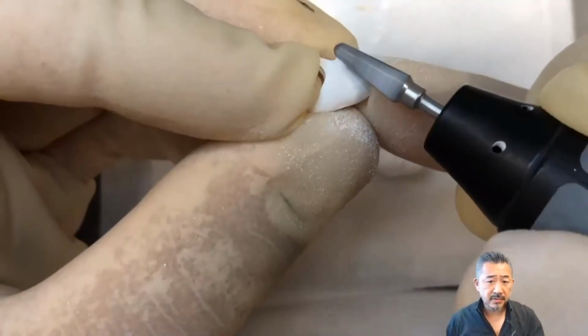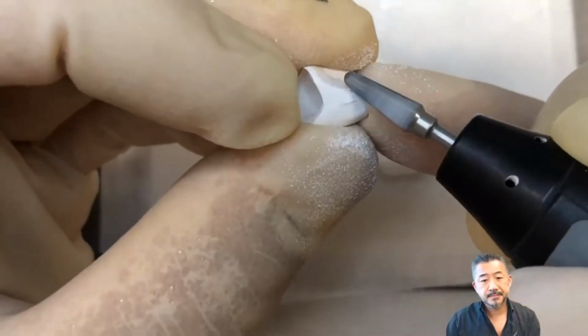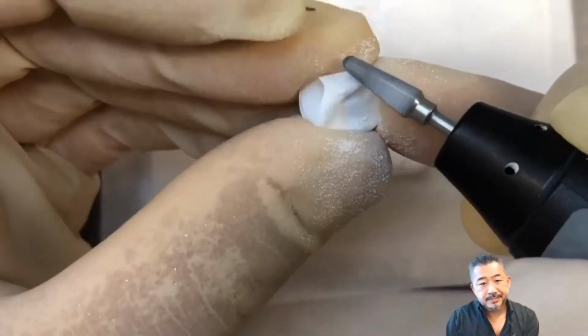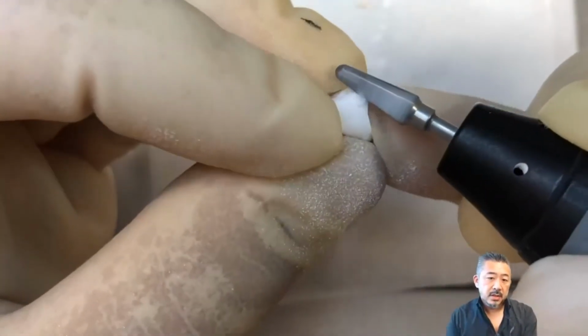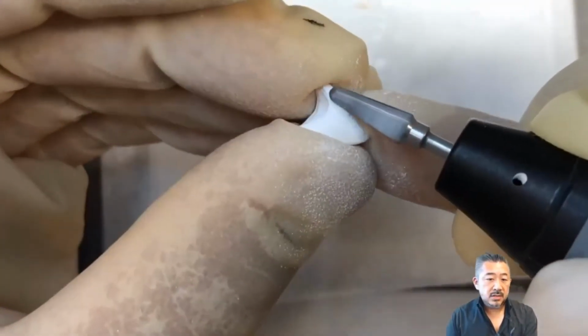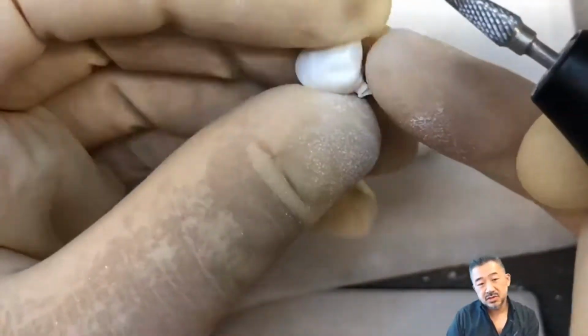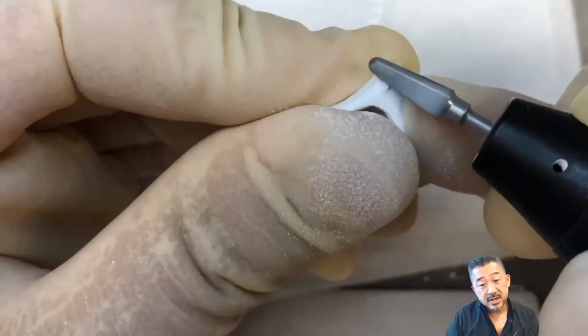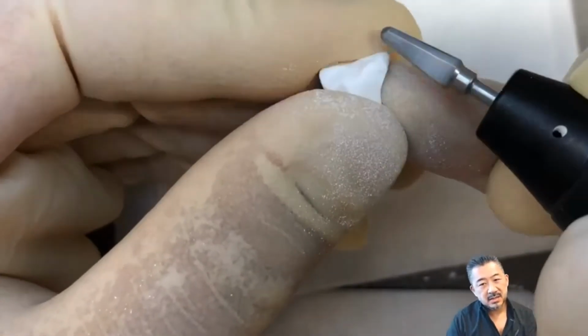So be careful not to cut too much. Don't touch the margins. From here, let's put on gloves and work. This is to prevent the oil from the hand from sticking to the zirconia, because the sintering liquid will not penetrate well if oil is attached. That's the reason.